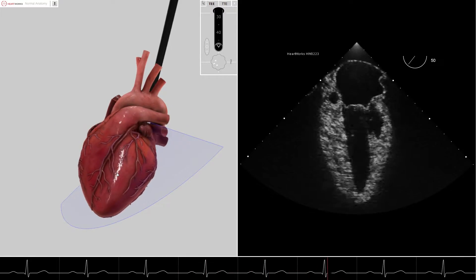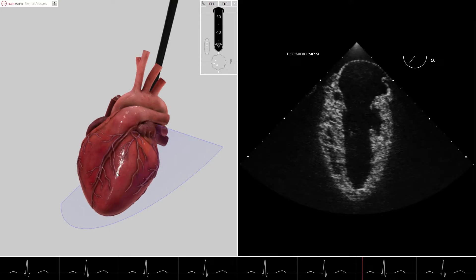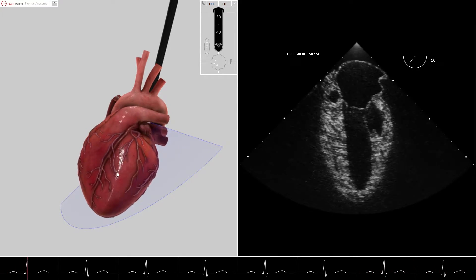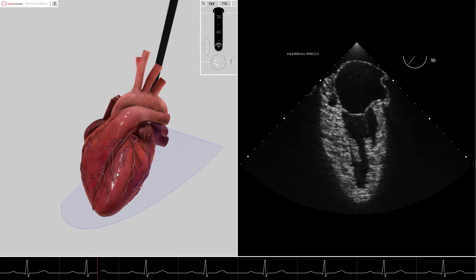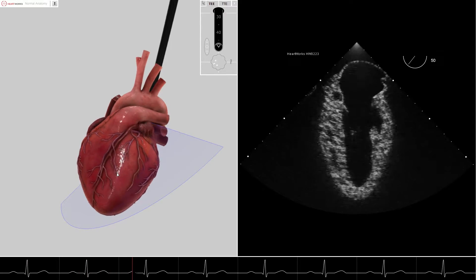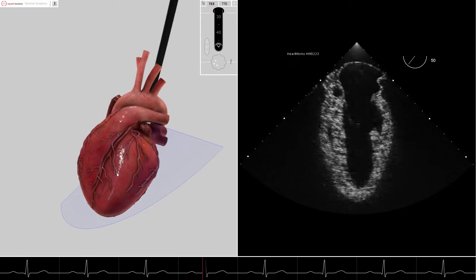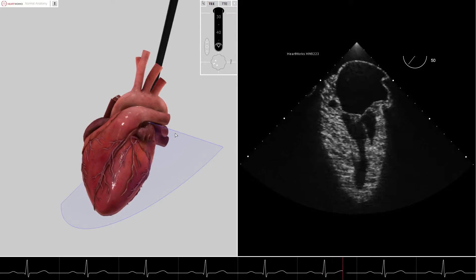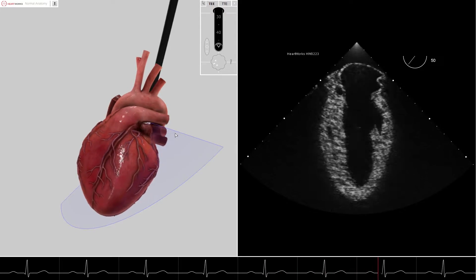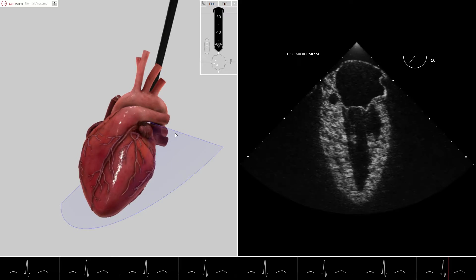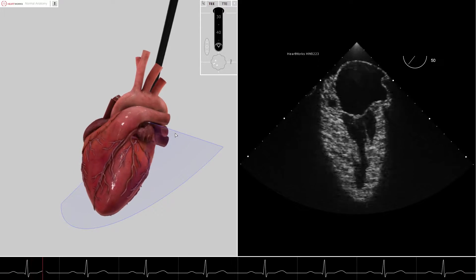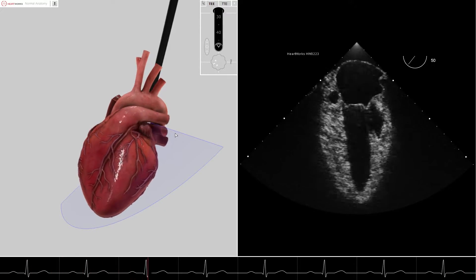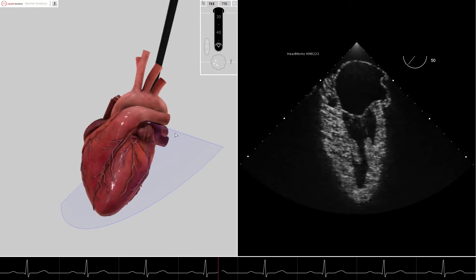In the next image, we simply advance the omniplane to 50 degrees. In this image, the marker side of the cut plane still represents the marker side of the true ultrasound image. However, now this side of the cut plane is moved from the anterior lateral wall closer to the junction between the anterior lateral wall and the true anterior wall of the left ventricle.